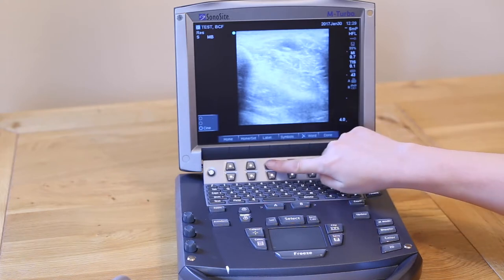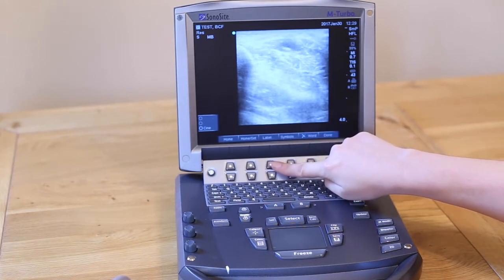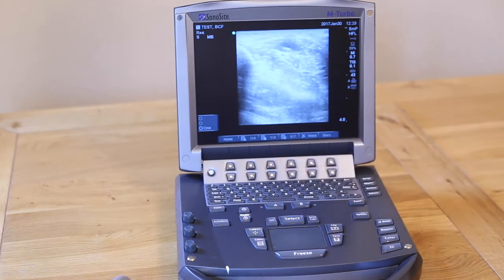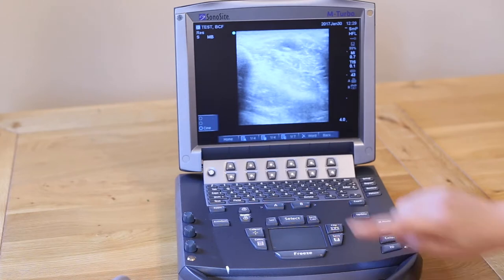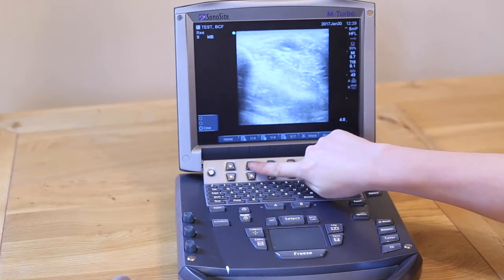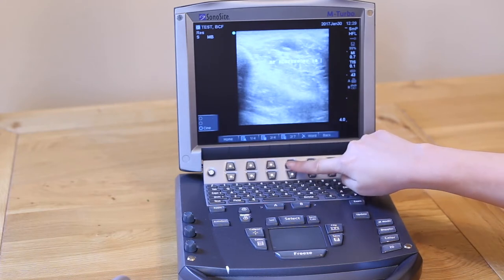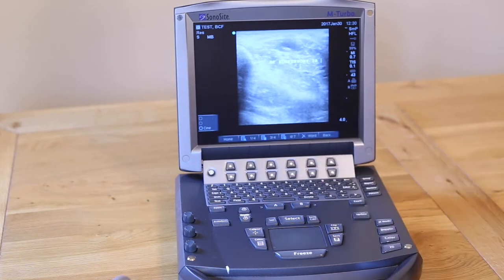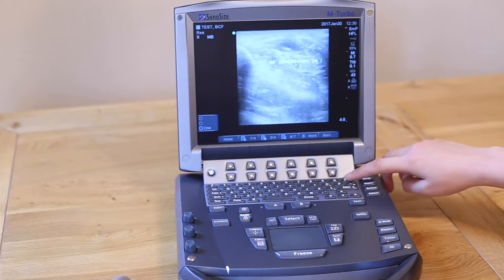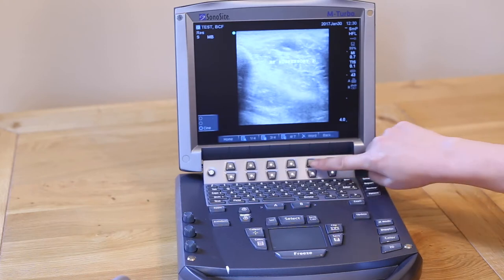The third soft key in from the left is a quick way of attaching commonly used words. Press this once to go into the Labels menu. We have three sets of common labels you can attach to the image. Again, we can either delete one letter at a time or one word at a time.